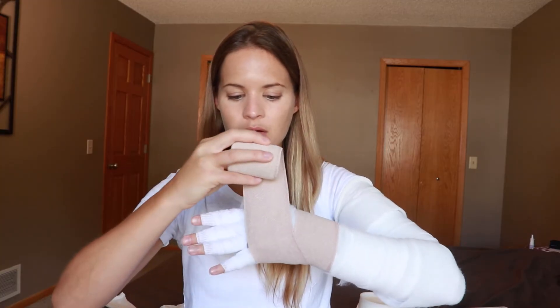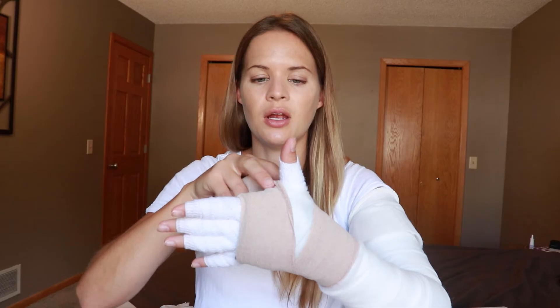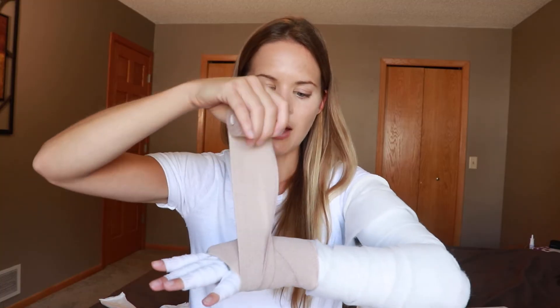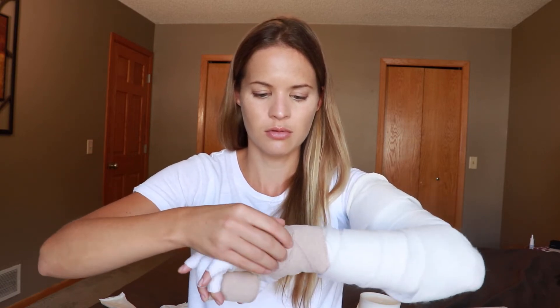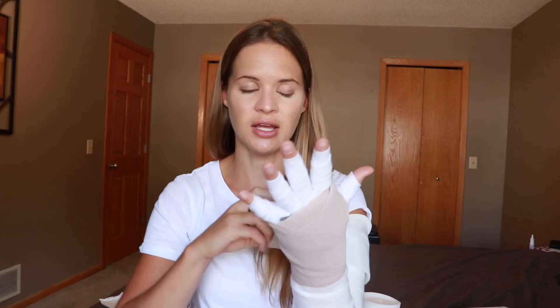Come around to cover up the end of the foam, up to the level of the knuckles, and then through. At the thumb, if you get a little extra fold, fold it over so you don't get a cut near your thumb. Come through a second time to add support. Sometimes it's easier to pinch and fold under so it doesn't roll up, then come through again with a little compression. After anchoring twice right at the knuckles, come under the thumb. Make sure you keep your fingers apart — that will help you avoid any tourniquets on the side of your hand.